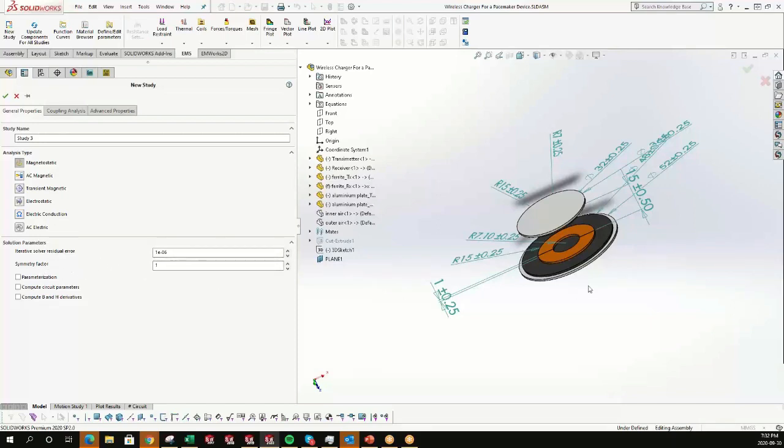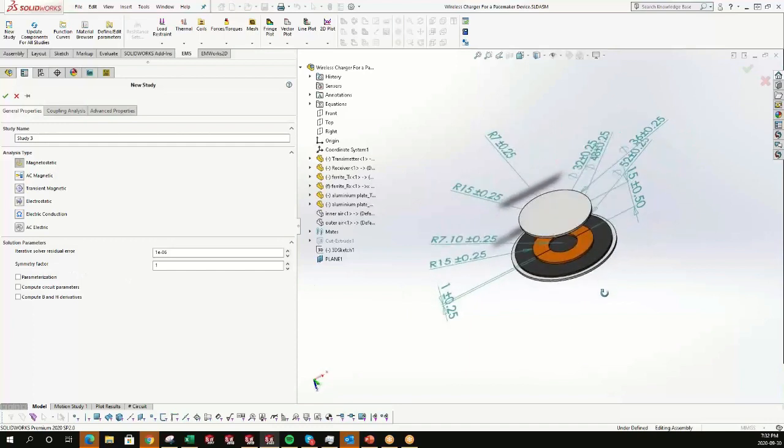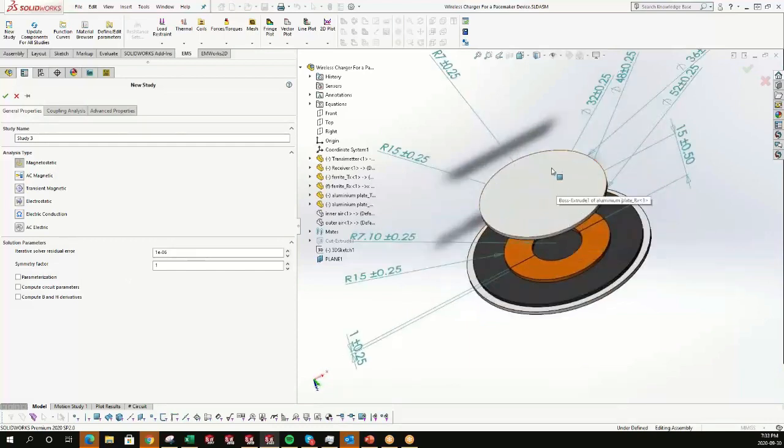We can use symmetry. Here we have an axisymmetric model, so we can run only a portion of this model by specifying the symmetry factor, and then the results will be automatically computed. We can enable the parameterization feature. This feature helps to parameterize both geometrical and simulation variables, and there are also additional options here.